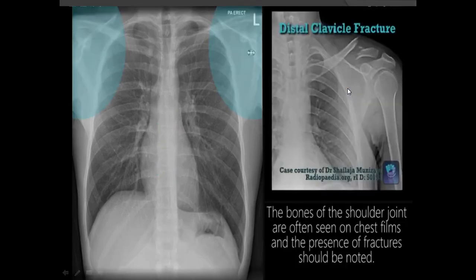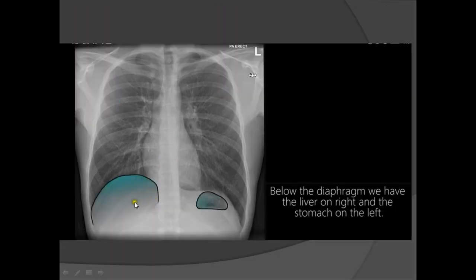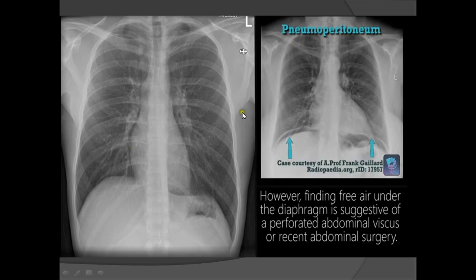Don't forget to check for clavicle fractures as described. Always look at the lung bases below the diaphragm to detect pneumoperitoneum or any abdominal abnormality, since abdominal pathology can radiate to the chest. A patient may present with chest pain due to an abdominal cause, so always examine below the diaphragm.